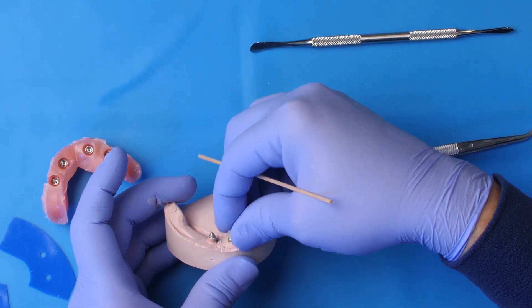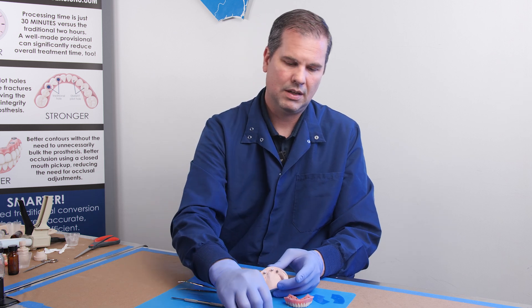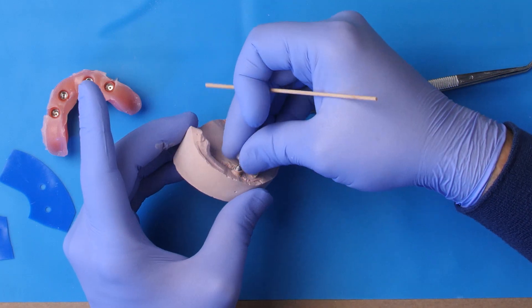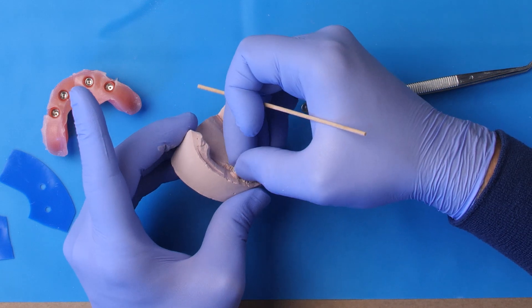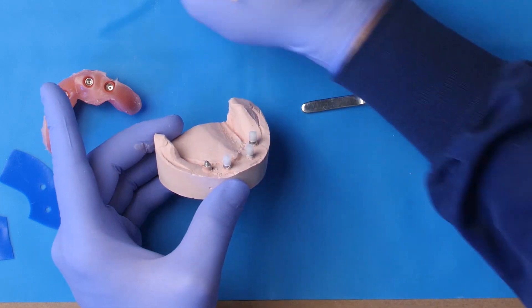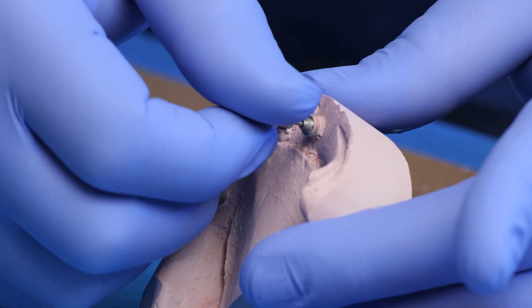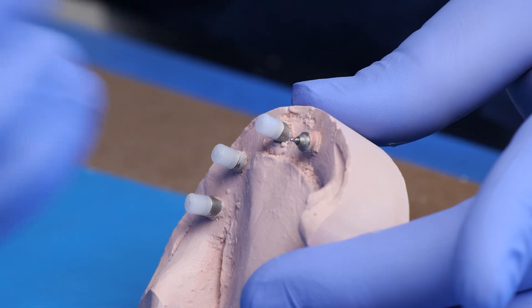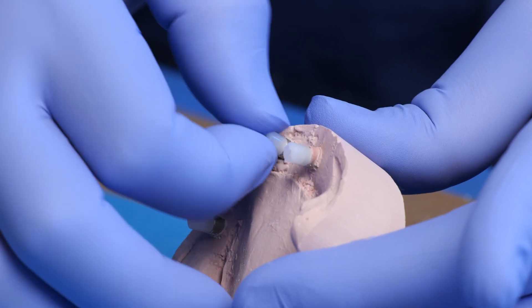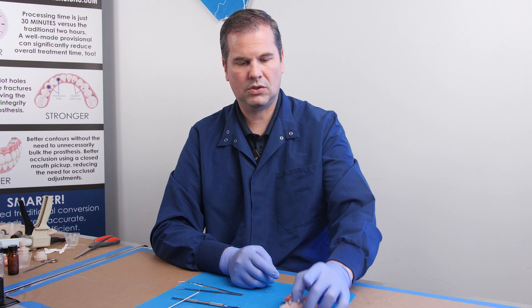You do not try to screw it down, because that will grab onto the threaded post that's in the multi-unit abutment and drive it further down. If you try to screw it on, eventually you won't be able to grab onto that with the press-on cap. So the retrieval tool allows you to get in there, back it up a couple of turns, and then just press the press-on cap down and turn it a little bit until you feel some friction. Now you've got your press-on caps in place, ready to go, and you can suture up.